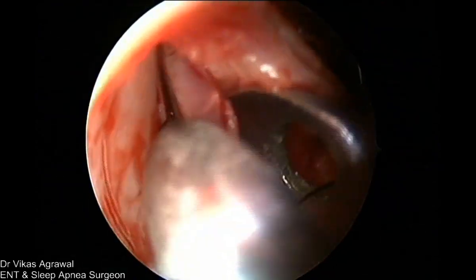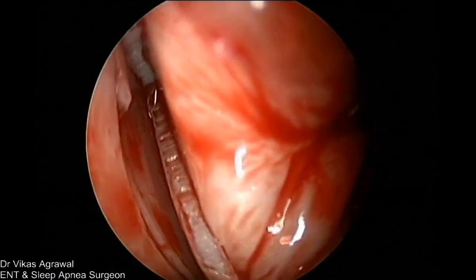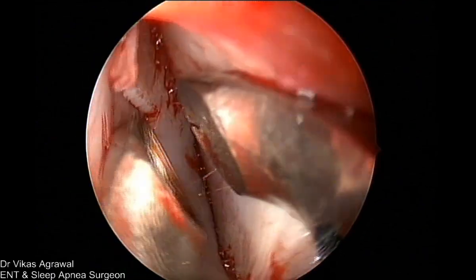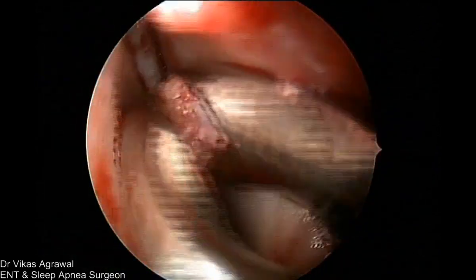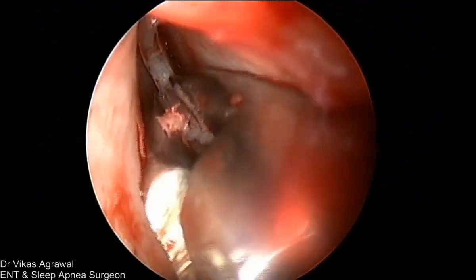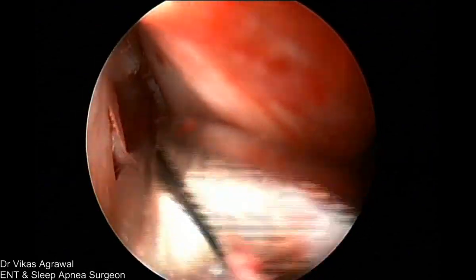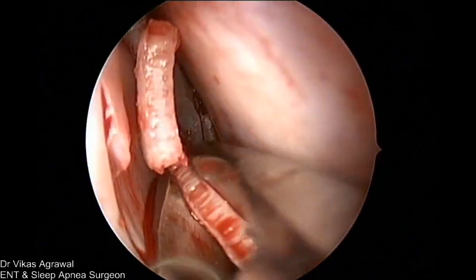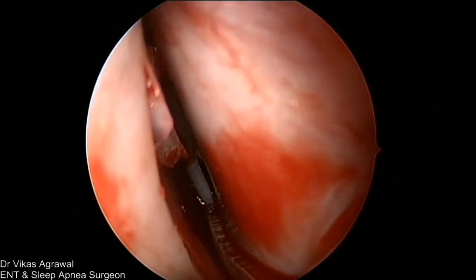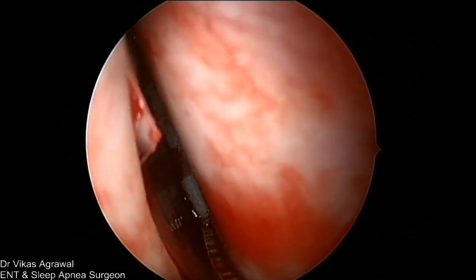So I have come quite anterior, as you can see here, but he will not get any deformity because I am below the nasal bones. And this is the area of the internal nasal valve if I do not remove that. I'll show you in a minute where that area actually is on the navigation. So at that time we'll go PIP once again.